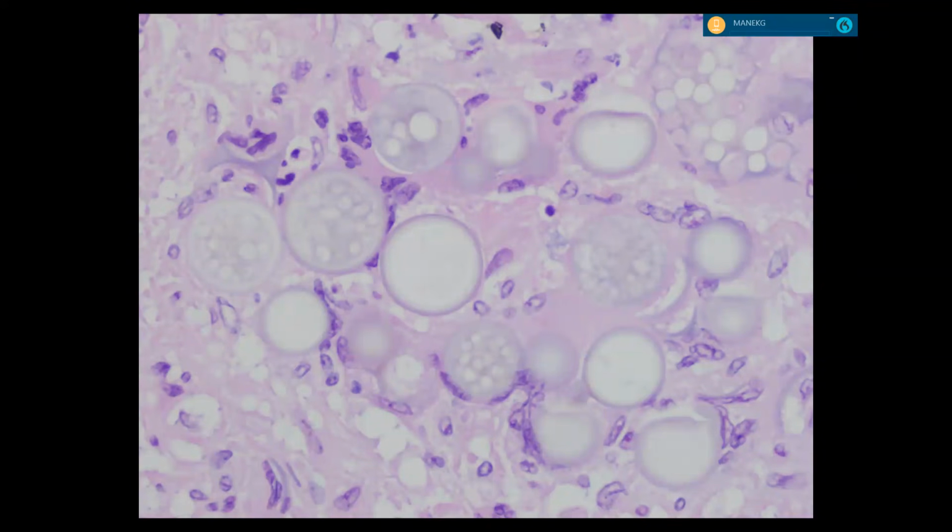So, a stain. Round spherules with tiny things inside. Very good. Cocci. Amazing. The big balloon is called a spherule, and the little balloons inside it are called endospores. That combination of spherule and endospore only happens in cocci. There's no budding or anything. It's just a thing filled with endospores.